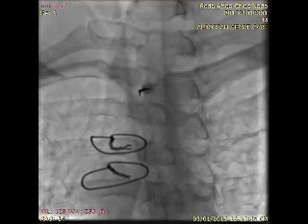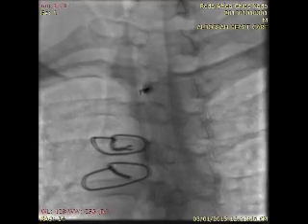Once the tip of the needle hits the vertebral body, it is rotated 90 degrees to slip off the body.